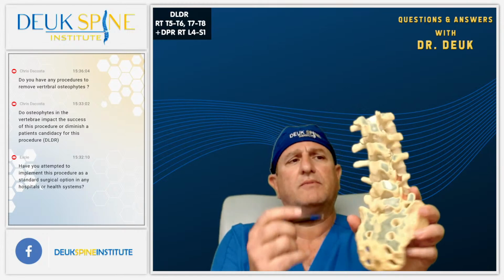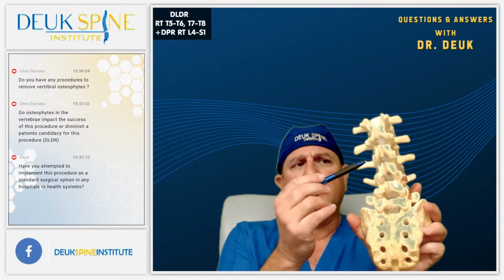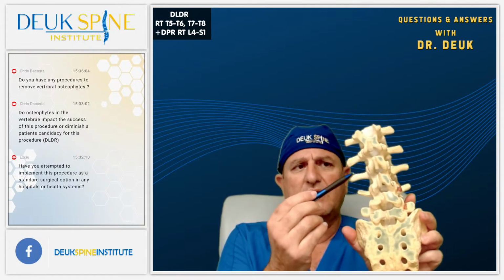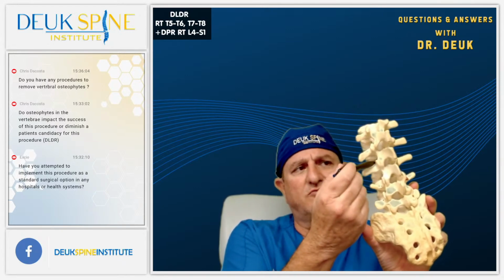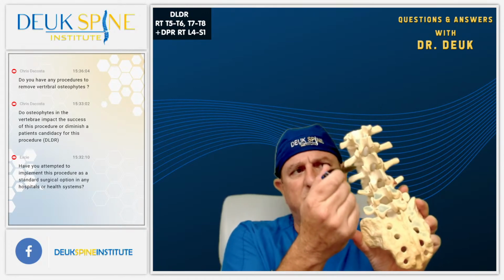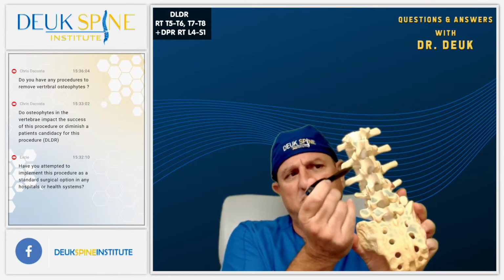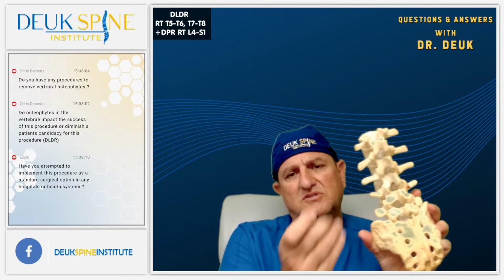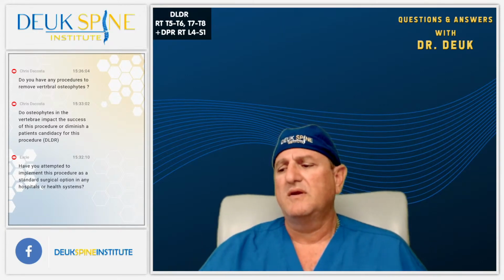There's some kind of weird anomaly that she has with her transverse processes. These are called transverse processes. They're bones that project off the spine sideways, and she had some kind of weird connection between these two, which makes it impossible for me to get into the disc from the transforaminal approach, because these bones were fused together rather than being a gap. So I was hitting the bone. I tried changing all my planes at T5-6 to get in, and I couldn't get past this weird bony connection that was there. And I think it's just the way she was born.